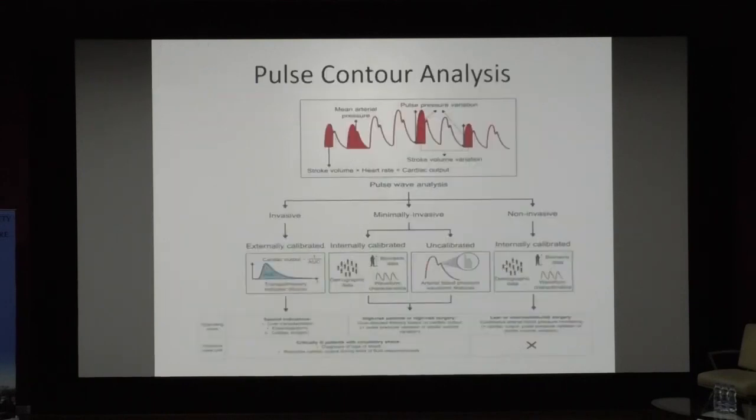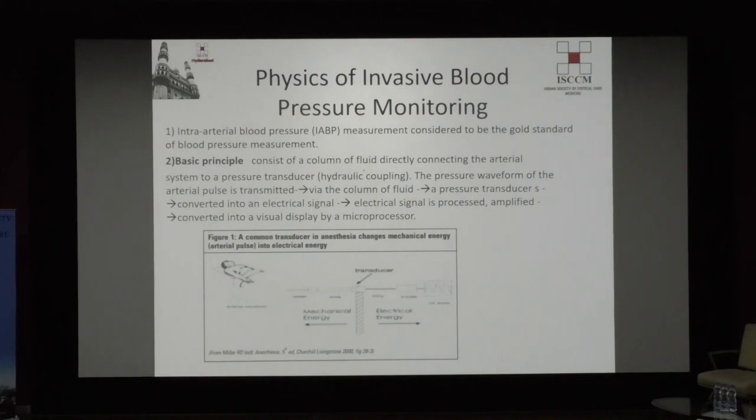So this will be discussed in the future. With the application of pulse contour analysis, there can be invasive, minimally invasive, and non-invasive, calibrated and uncalibrated systems. The most commonly used in clinical practice are PiCCO and LiDCO. We'll discuss this in future presentations.